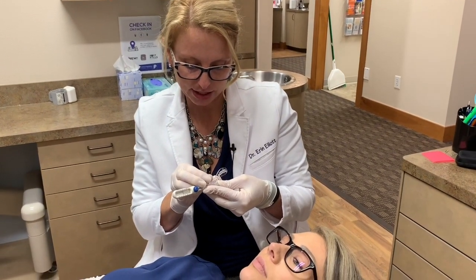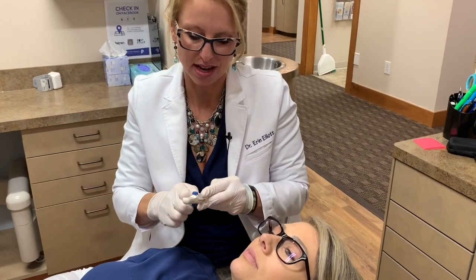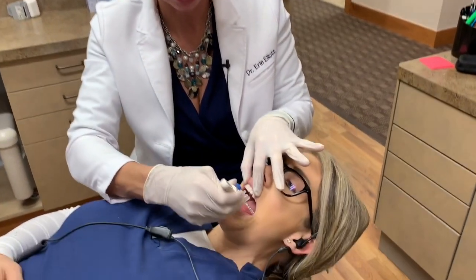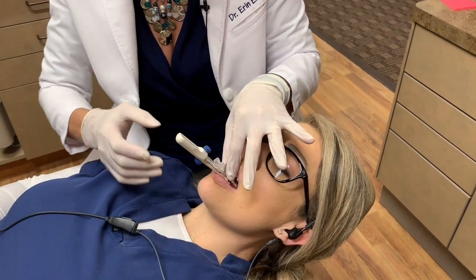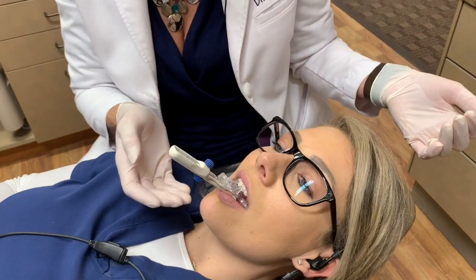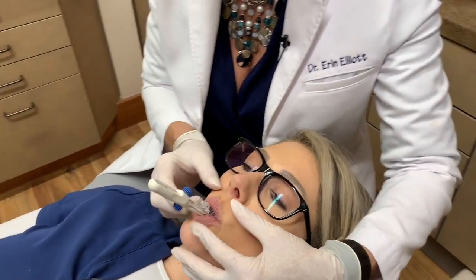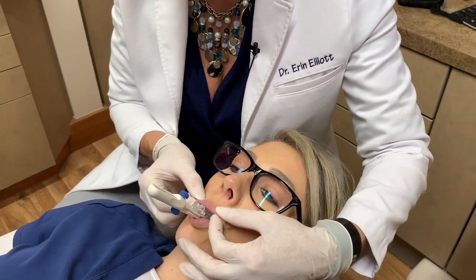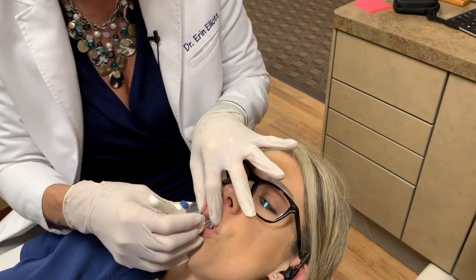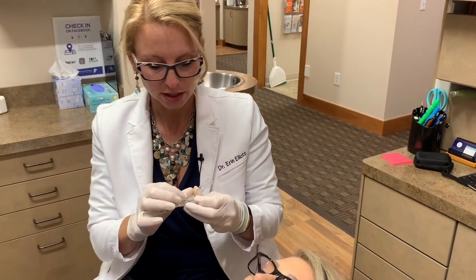What I like to look at is whether we have separation of teeth — is it going to cause too much vertical where we don't get lip seal? Lip seal is really important. You can see how open you are at vertical 8. Rarely any noise there. Go ahead and relax your lips — you can notice how you won't be able to get your lips up and around an appliance at that height. So we're going to go back down to 4.